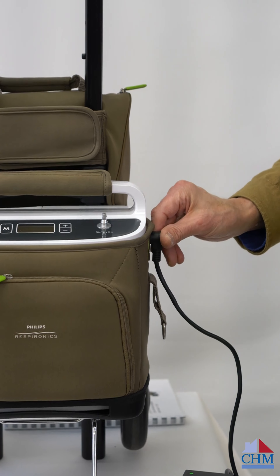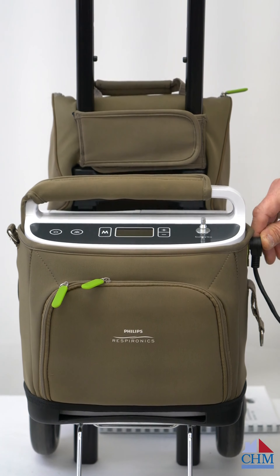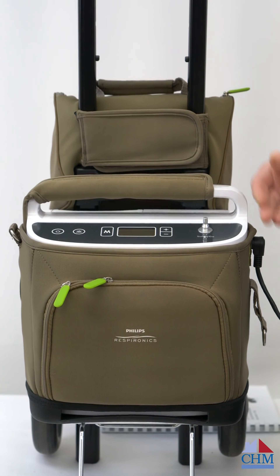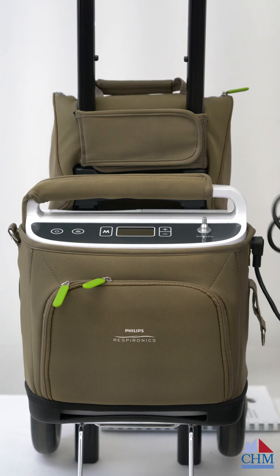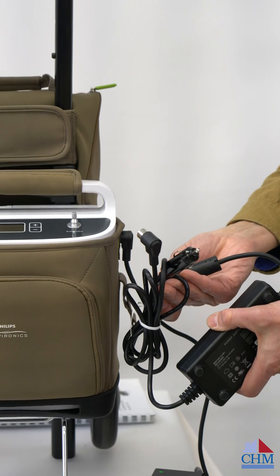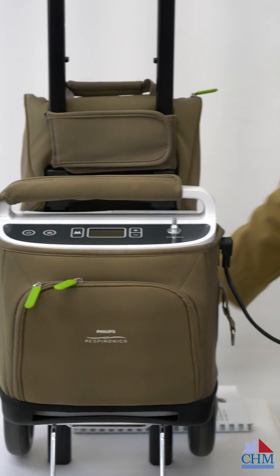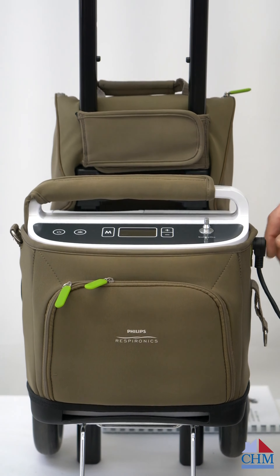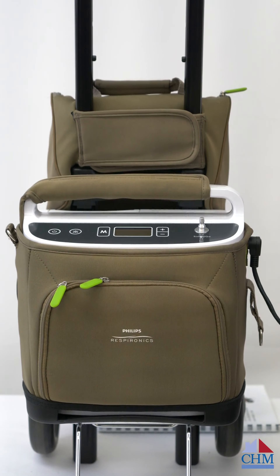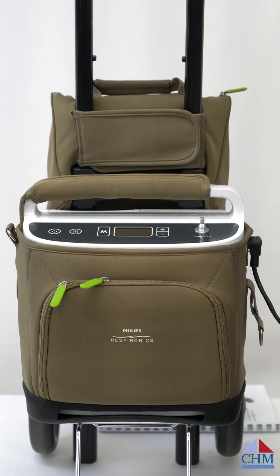An important thing to note about these POCs is that when they're plugged in, they will just continue to run. So if you're traveling, it's very handy — just plug it in with the car adapter. When you get to your destination, a hotel or wherever, you can use the battery to get inside the building. Once you're in your room, just plug it in and you're good for the night or the rest of the day.